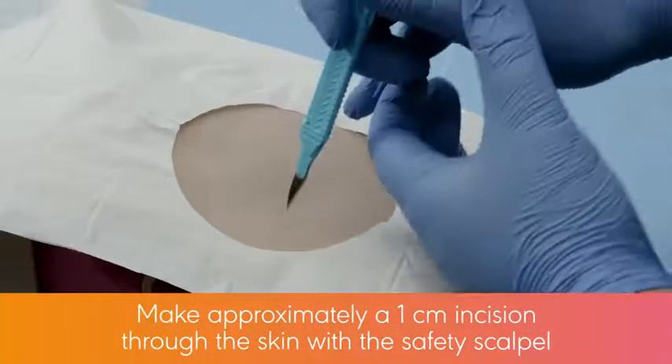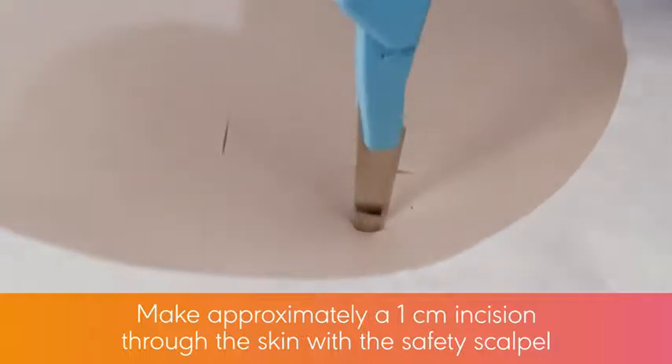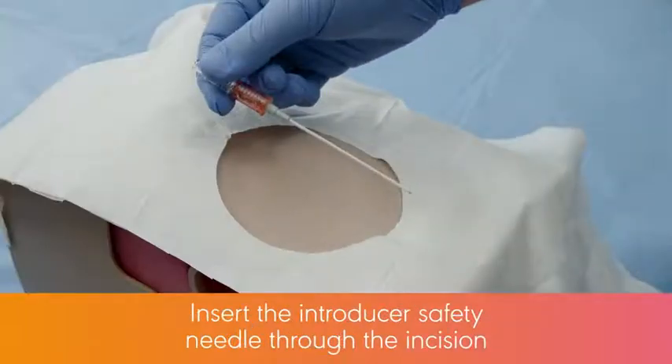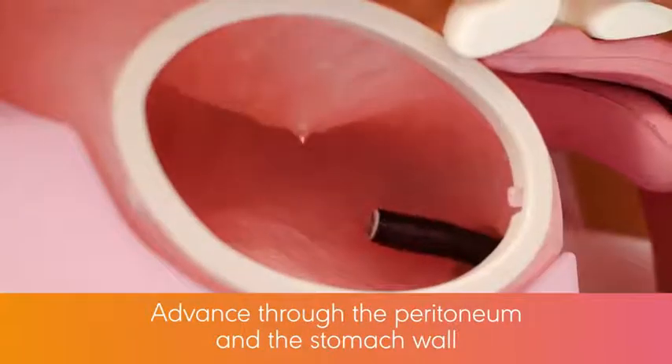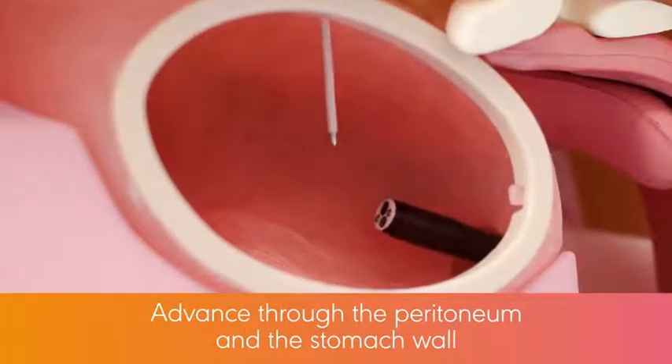After making approximately a 1 cm incision through the skin with the safety scalpel, insert the Introducer Safety Needle system through the incision, advancing through the peritoneum and the stomach wall.